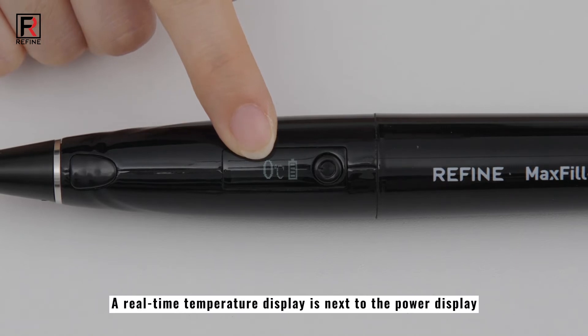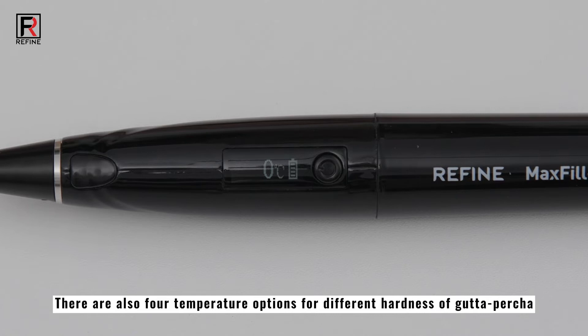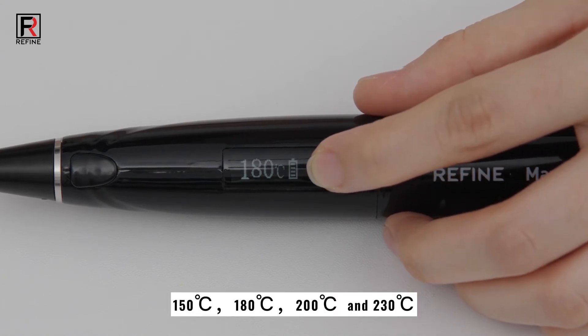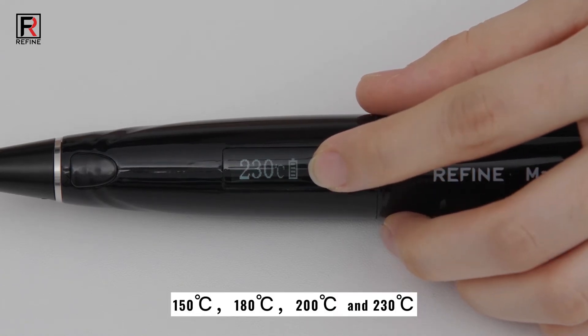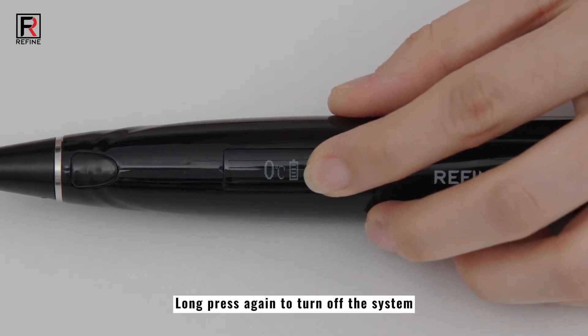A real-time temperature display is next to the power display. There are also 4 temperature options for different hardness of gutta percha. Short press to adjust the temperature. Long press again to turn off the system.